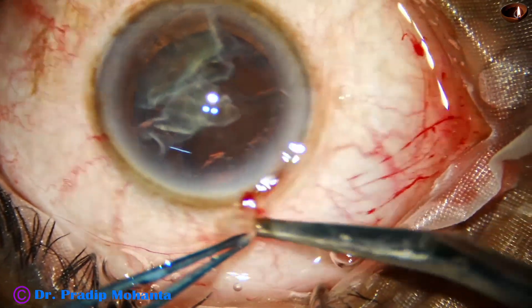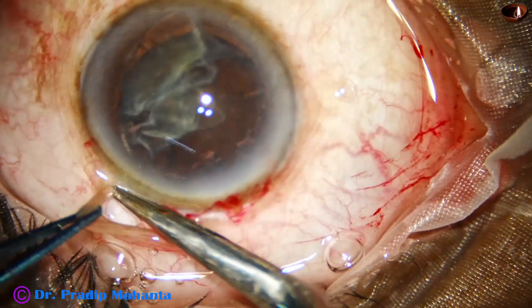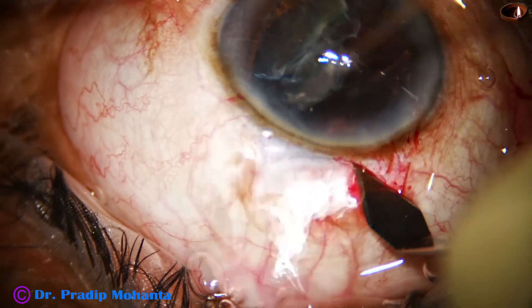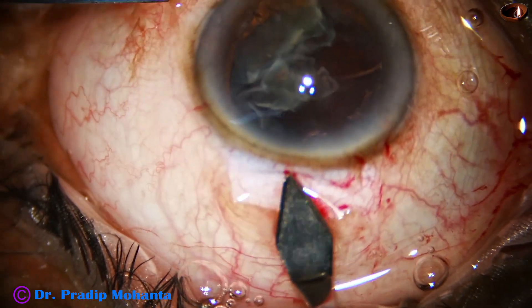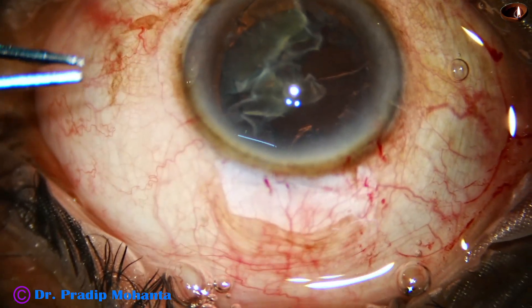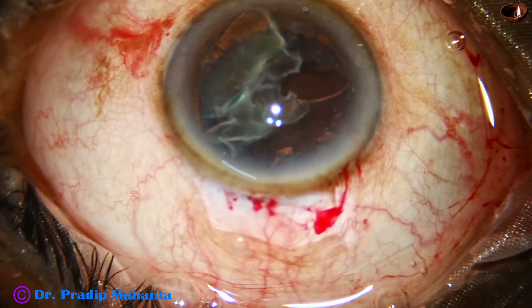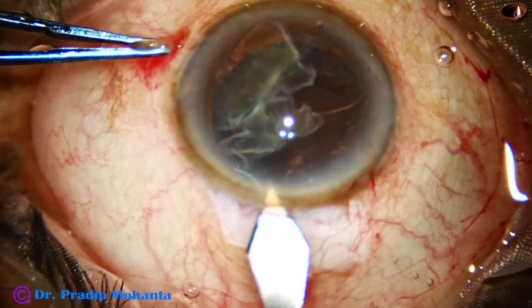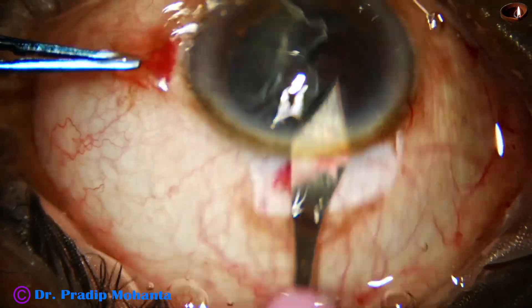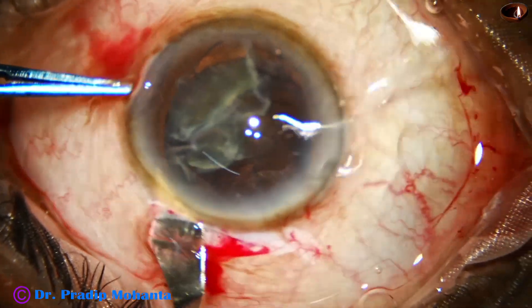Now I do a small peritomy of about 6 millimeters. I take a keratome — not the crescent knife — and just mark the approach. I enter the anterior chamber making the tunnel by the keratome itself and extend the tunnel on either side to get a sclerocorneal wound of about 6 millimeters. My plan is to implant a rigid PMMA IOL in the sulcus because the patient cannot afford a multipiece lens.